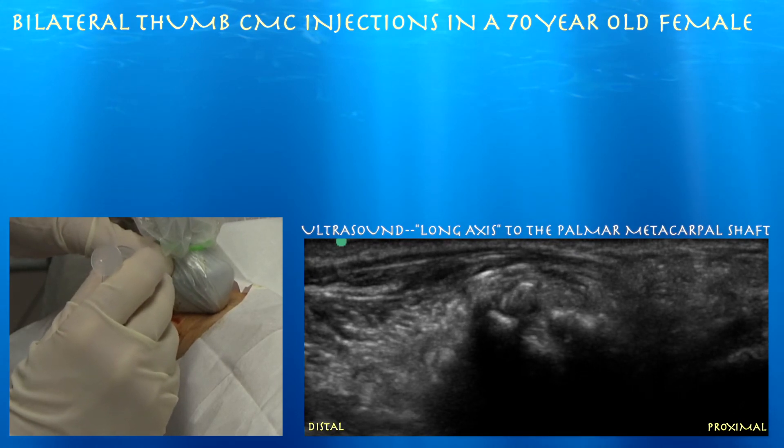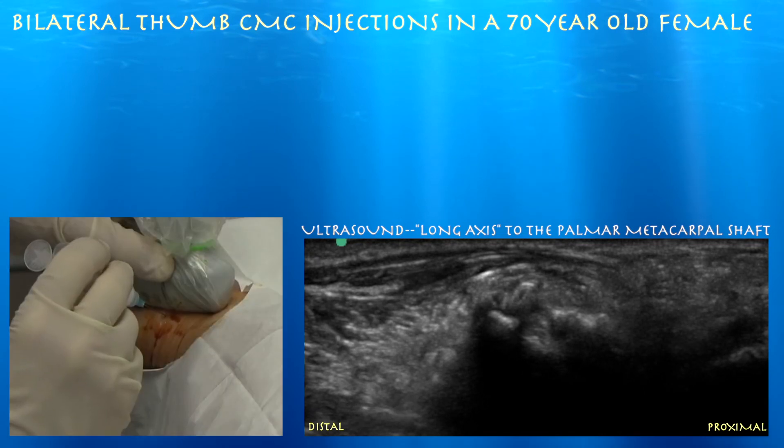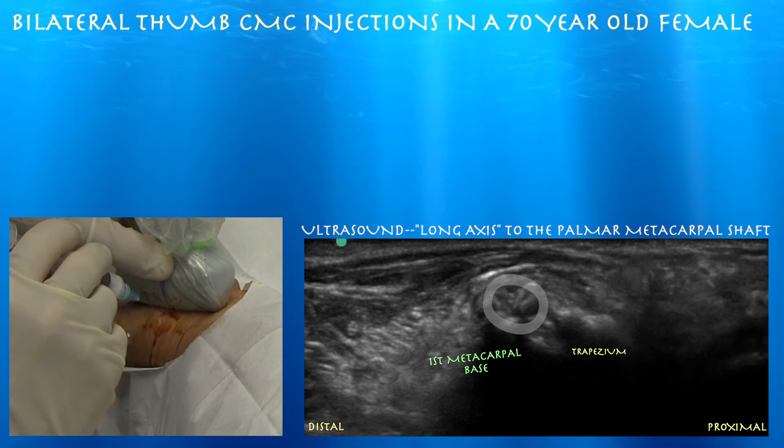You can really just see tissue move through basically a jiggle technique, so you can get little glimpses of the needle in short axis. And it appears to be in a good position.